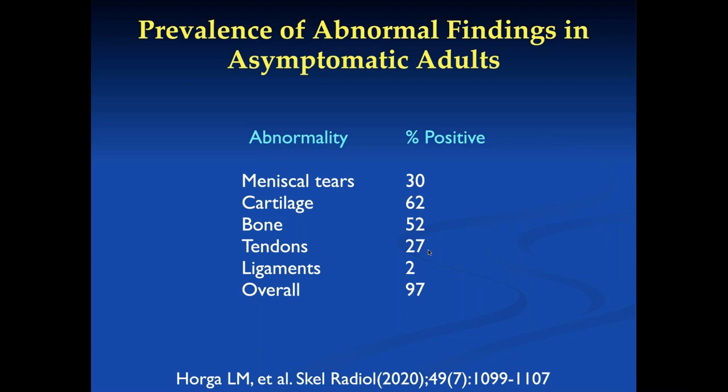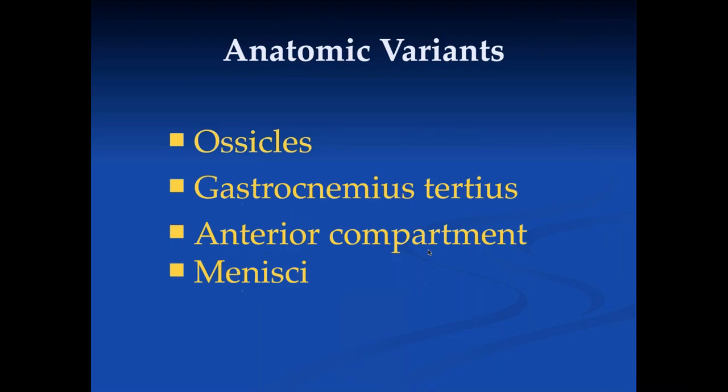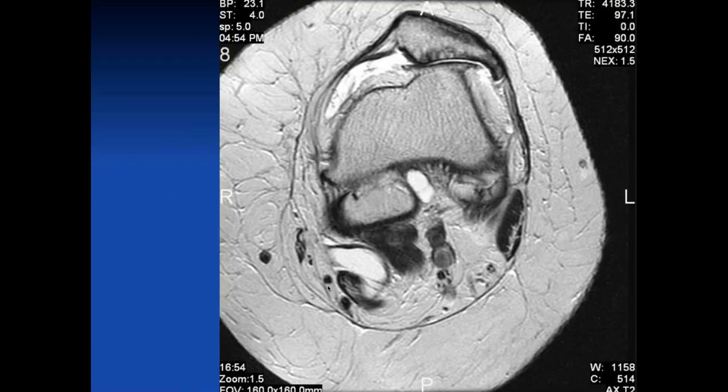There are a lot of anatomic variants, including ossicles and different soft tissue variants, and many variants in the anatomy of the anterior compartment and menisci. Here's a patient with fusions, some cysts, a popliteal cyst, and a lot of increased fat — I believe fat is a major risk factor for disease in the musculoskeletal system, so I comment on it when I think it's abnormal. There's also a fair amount of muscle atrophy, another major risk factor for degenerative disease.